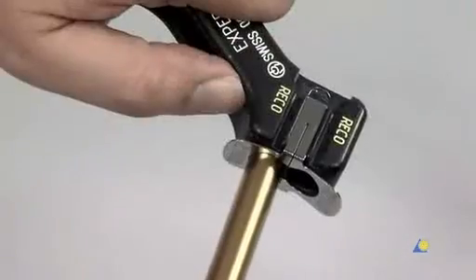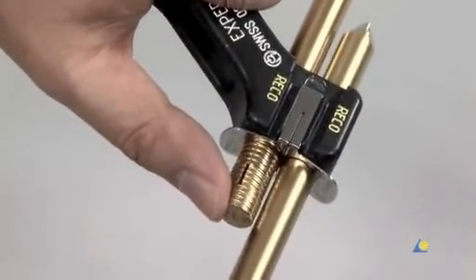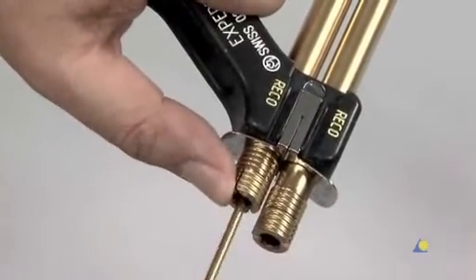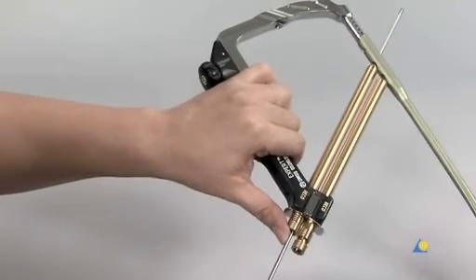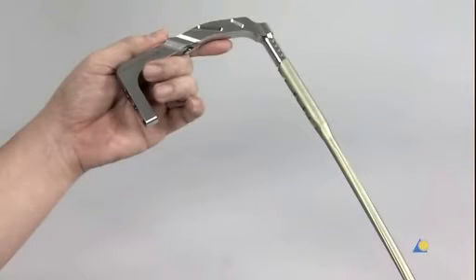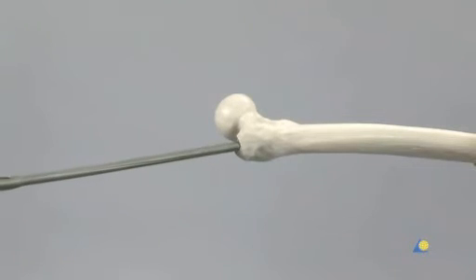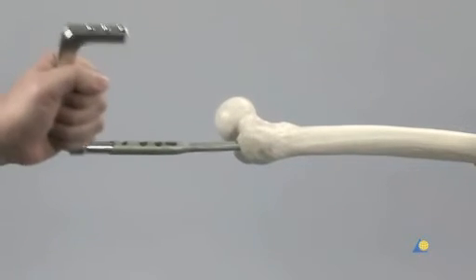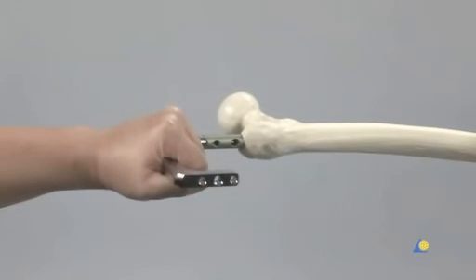The three-part trocar combinations are introduced through the recon holes in the insertion handle. The trocars are removed and two guide wires are inserted. If the guide wires pass correctly through the recon locking holes in the nail, the nail can be inserted. The guide wires along with the sleeves and aiming arm are removed. With the patient positioned supine, the insertion handle initially points towards the ceiling. The nail has spiral flutes on its surface to help rotational movement during insertion. When the nail is advanced into the bone, it rotates 90 degrees, and the insertion handle now points to the lateral side.